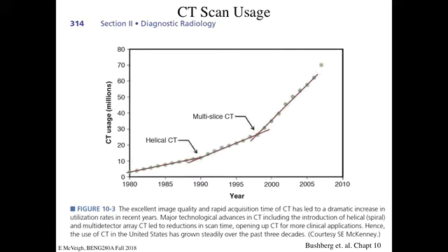So living here, walking around, getting hit by cosmic rays, and radon is the biggest source of your exposure to radiation. You get about 3 millisieverts a year. You won't know what those units are, but let's just say it's 3 millisieverts a year. A CT scan can be anywhere from 1 to 15 millisieverts, sort of in that area. So you can be around the baseline exposure. So if people are getting 5 millisievert scans and 100 million people are getting them, then the baseline radiation dose for the whole population goes up.